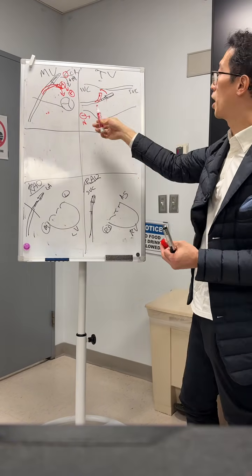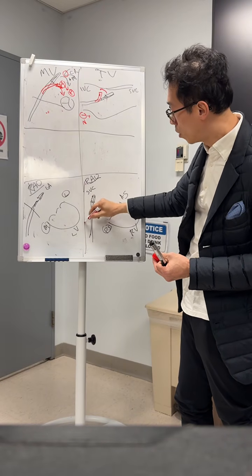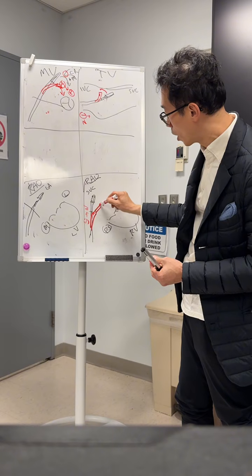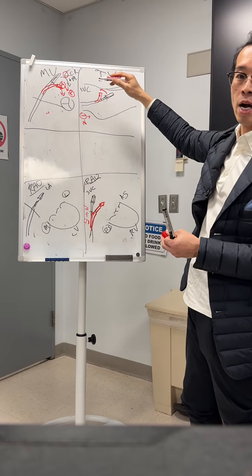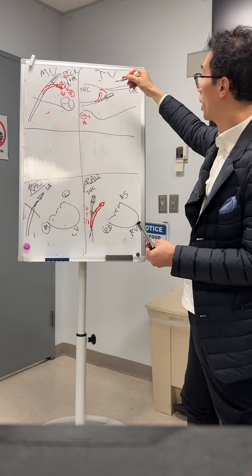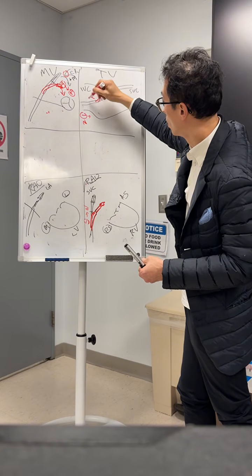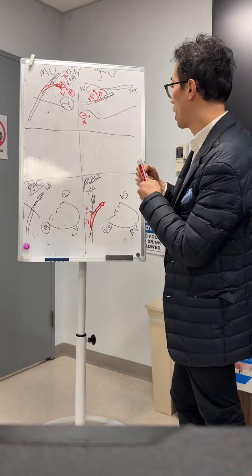Right? Because remember, this is tricuspid. This is minus first. So when you go minus to neutral, what happens? You're going to have a little bit of a curve, right? It's already getting this way. So on top of that, though, you need to rotate the guy upside down so that you are in that position to start flexing. Okay? So flex is going to go all the way down. Okay? On the equivalent of the tricuspid view.